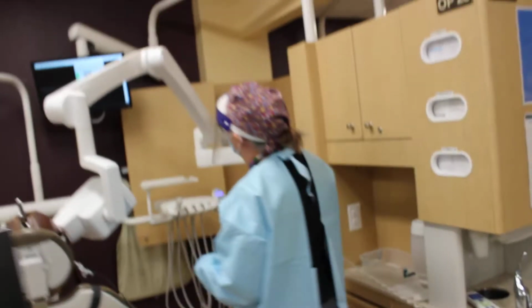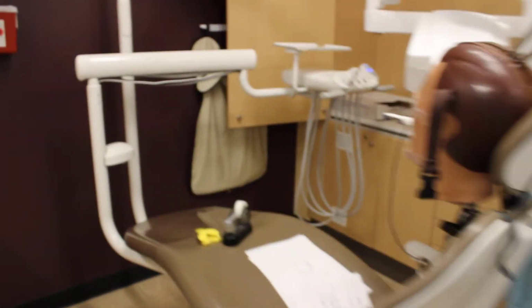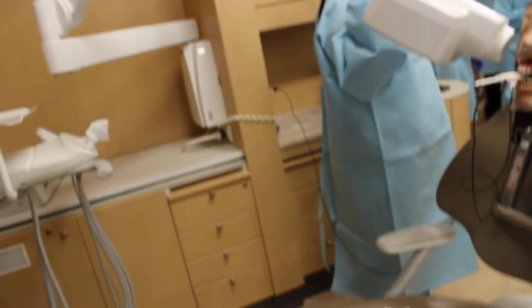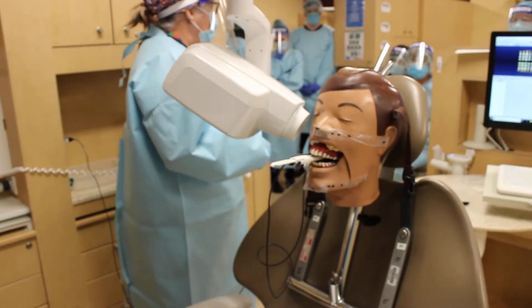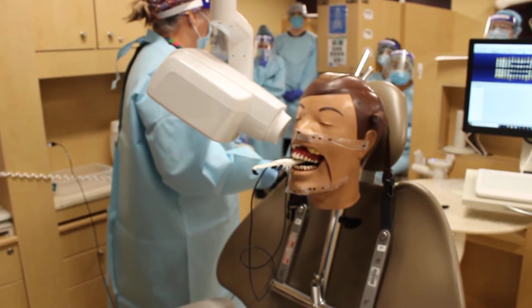So I'm a little too high. Did I get the apex? Yeah, the apex. The doctor wants to see if there's an infection in tooth number 2. What's the whole point of being a periapical? It's to get the roots of the teeth. Now the crowns you're going to get with the bite wing. So this is actually diagnosable. Okay?